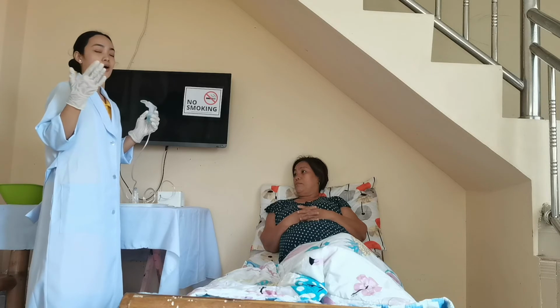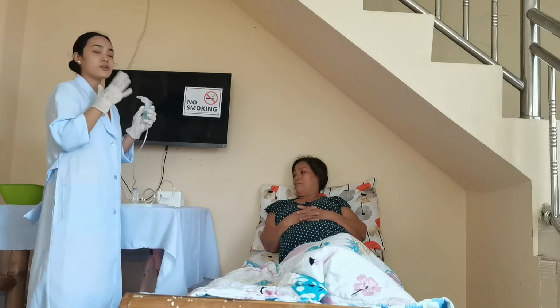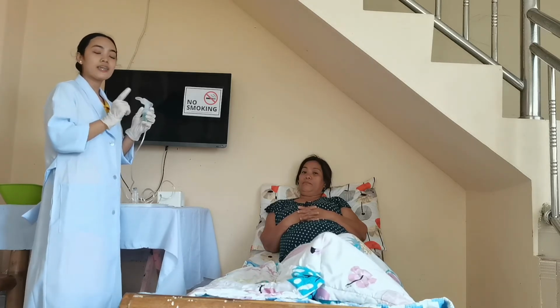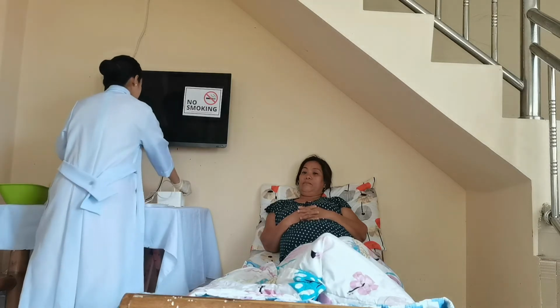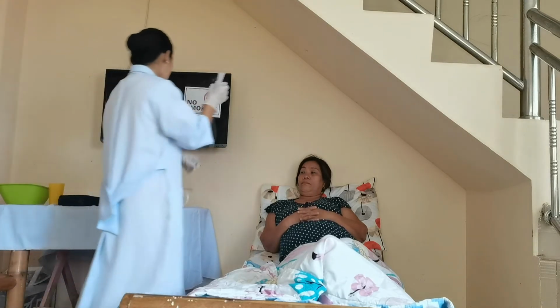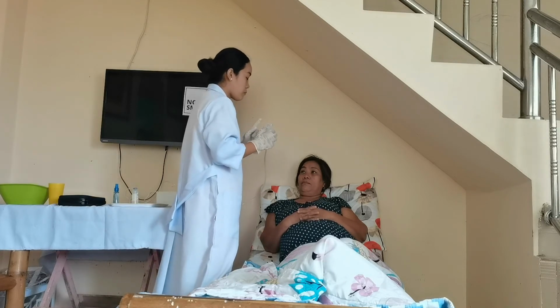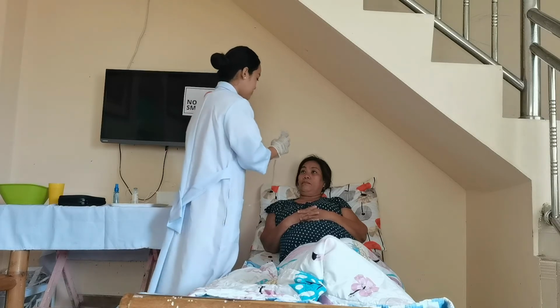and then we have to take note that a mist is being emitted into the mouthpiece, and then we will place the mouthpiece on the mouth of our client and have her secure it with her lips and teeth. So there we go, we have the mist. So ma'am, ganito po yung gagawin natin. Ilalagay po natin itong mouthpiece po sa bibig po ninyo, and then po, isi-secure nyo po gamit yung labi po ninyo and bibig po. Okay po ma'am?